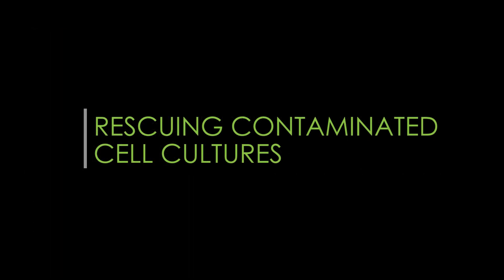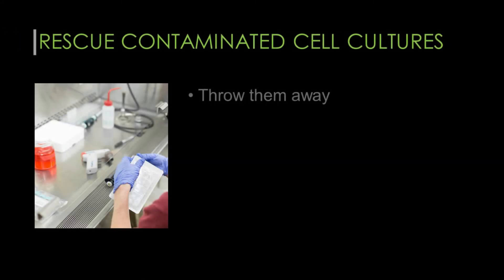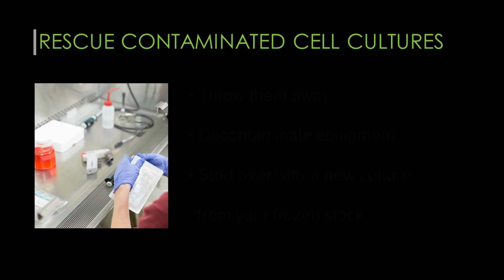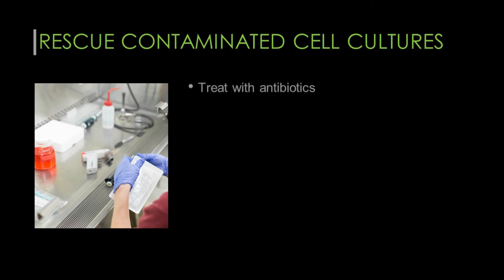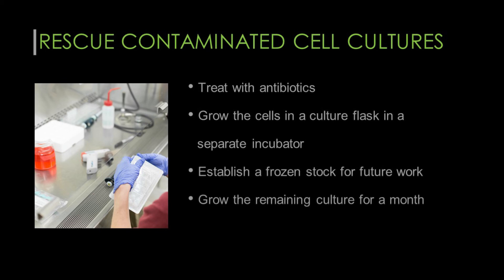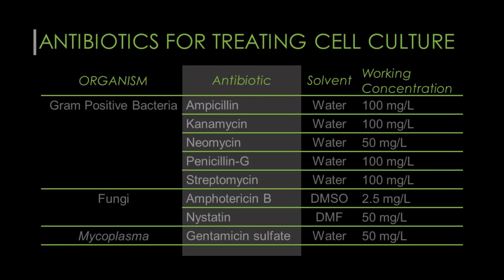How do you rescue contaminated cell cultures? Usually the best thing to do with contaminated cell cultures is to throw them away, decontaminate equipment, and start over with a new culture from your frozen stock. However, if you absolutely have to keep it, you can try to rescue it by treating it with antibiotics and growing the cells in a culture flask in a separate incubator. Once you're sure the contaminants are completely clear, establish a frozen stock for future work, grow the remaining culture for a month, and retest it for contaminants. Here's a chart of some antibiotics commonly used for treating contaminated cell culture, and you can find a link to the full protocol in the video description.